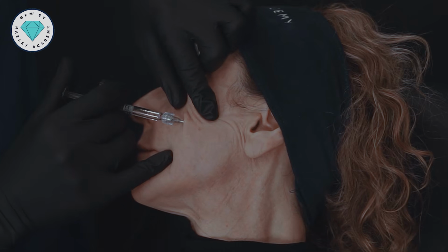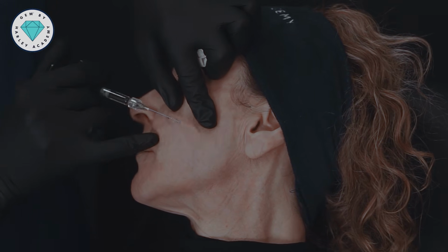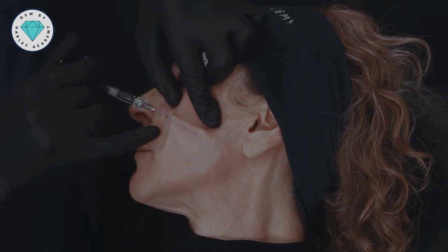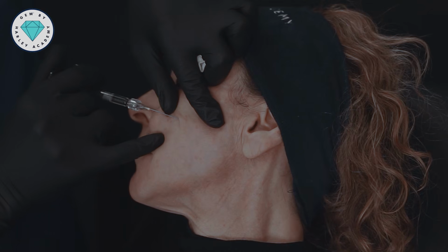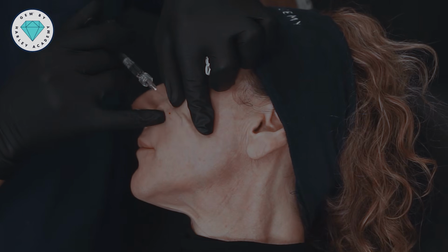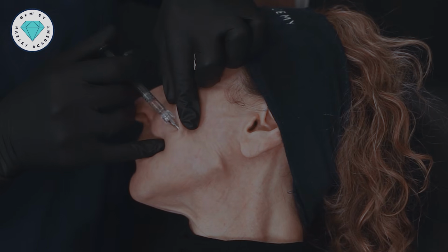Whenever you're in that subcutaneous layer as well, you will often feel some resistance, and it's very difficult to reposition your cannula without coming back towards your entry point. So if you're all the way in and you want to angle down 10, 15 degrees, that'll be very challenging. So as Tristan's doing, coming all the way back, changing your direction, and then advancing again.